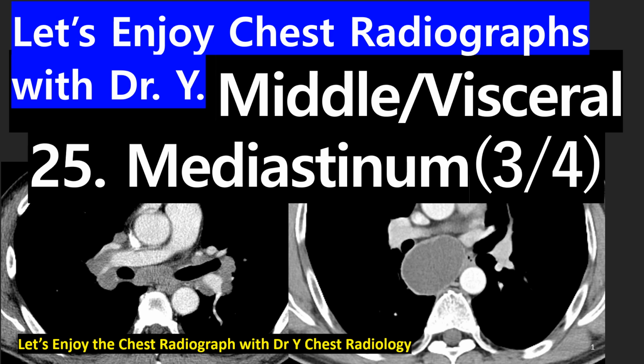Today's session will be session 25, middle or visceral compartment of mediastinum. Lesson 3 of 4 of mediastinum.